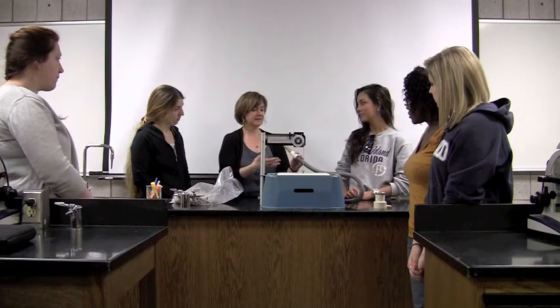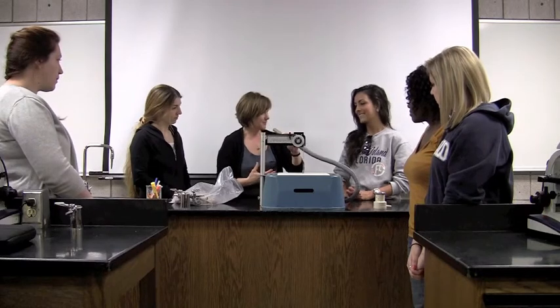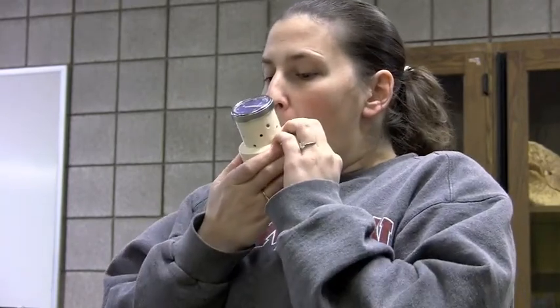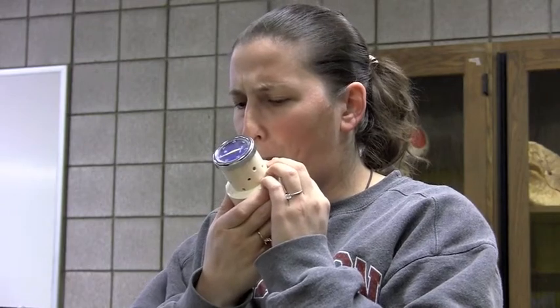There are different types of spirometers. The type commonly used in an anatomy and physiology lab measures the volume of air being moved in milliliters. Some types of spirometers measure the rate at which air is moving in or out, and some types measure both volume and flow. Let's take a look at a few different types of spirometers.